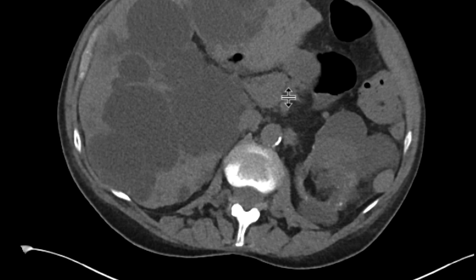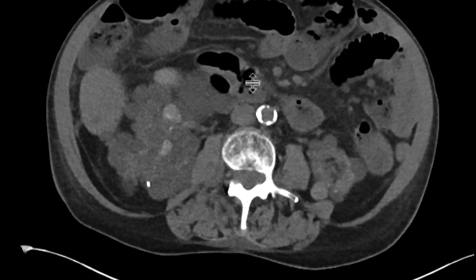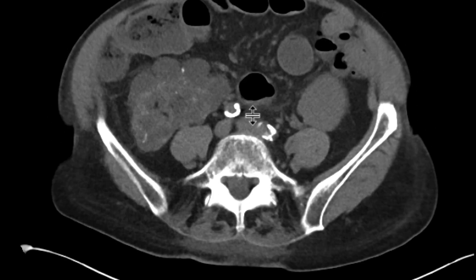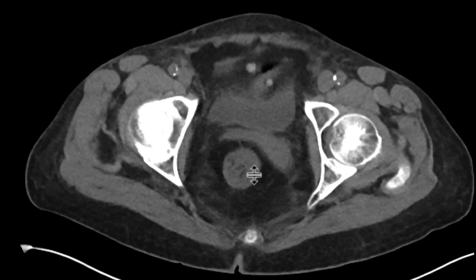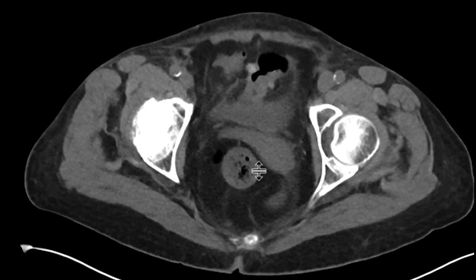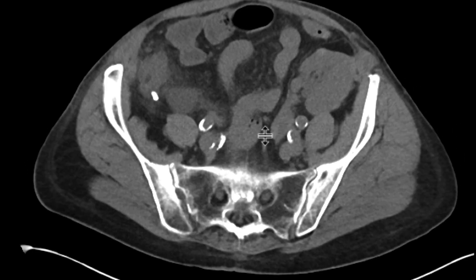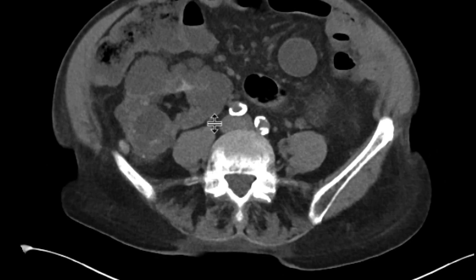They didn't want to give intravenous contrast, and they didn't want to give oral contrast as well, so I think that's what makes this case a little bit challenging. The patient has right lower quadrant pain. As you scroll down, we can see that there is some abnormality in the right lower quadrant, certainly some inflammatory change right around there.